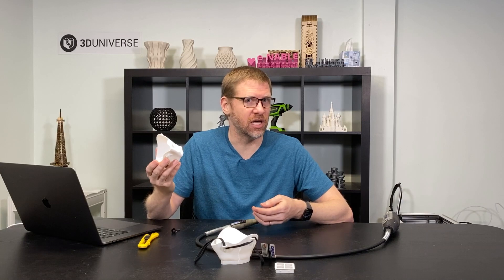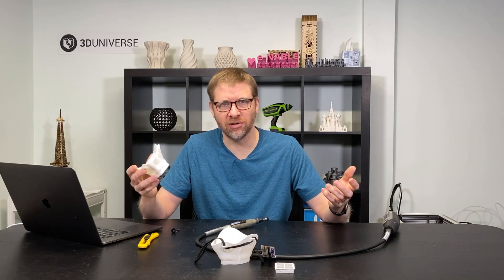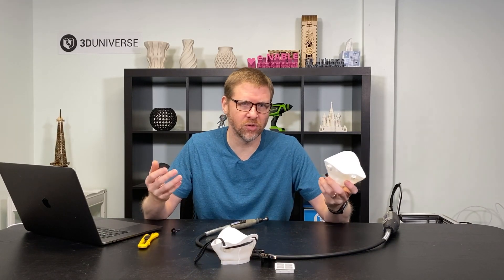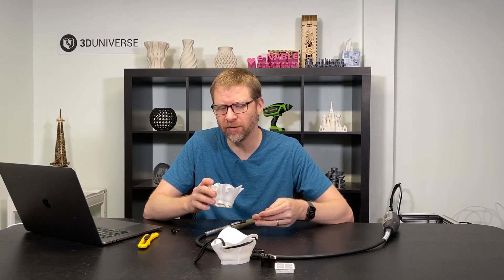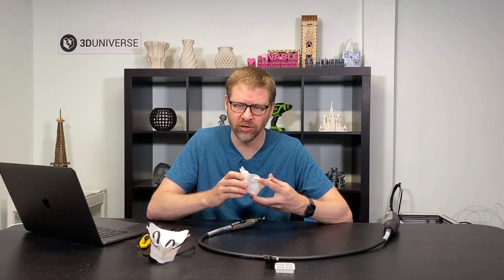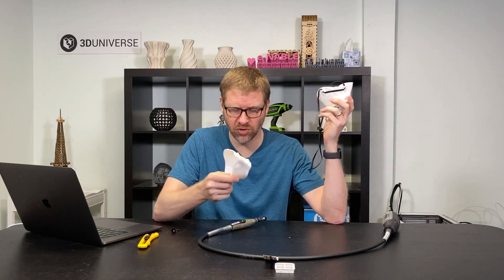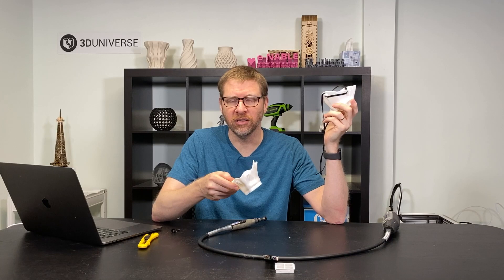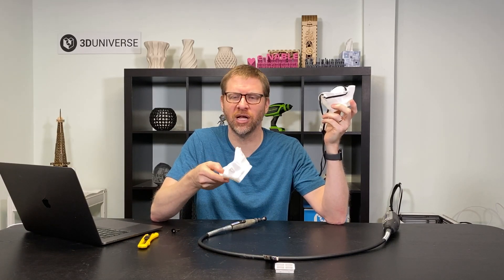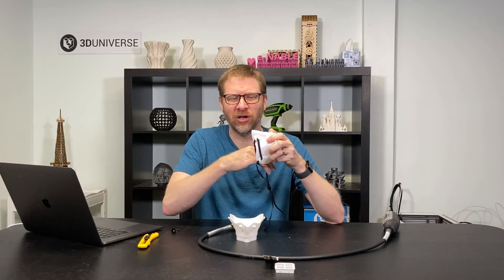You might also consider setting the mask aside once it's all packaged up and bagged — set the whole thing aside for a period of several days at least, to make sure that if there is any remnant of the coronavirus in there, it would not survive most likely beyond that three to five day period. Also, I do recommend that you wear a mask yourself when you're doing this rotary tool step, because using a tool like this is going to create very fine particles of plastic, almost like a dust that gets into the air, and you don't want to be breathing that in.